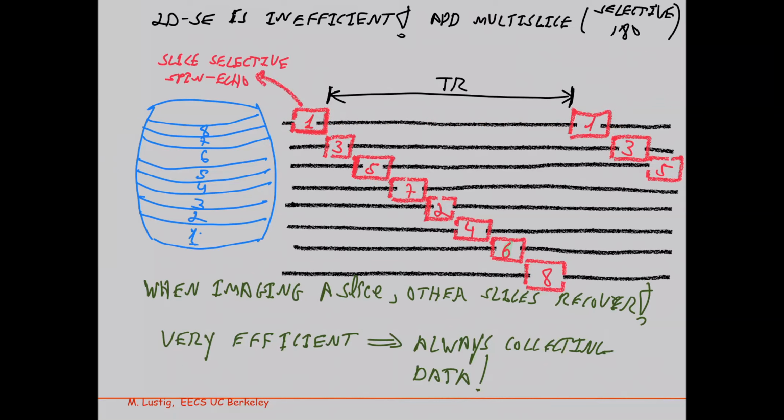And then there's another thing related to what's called magnetization transfer.